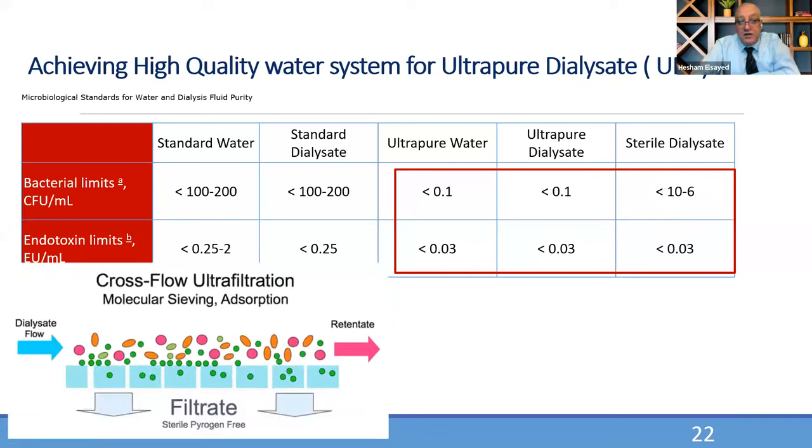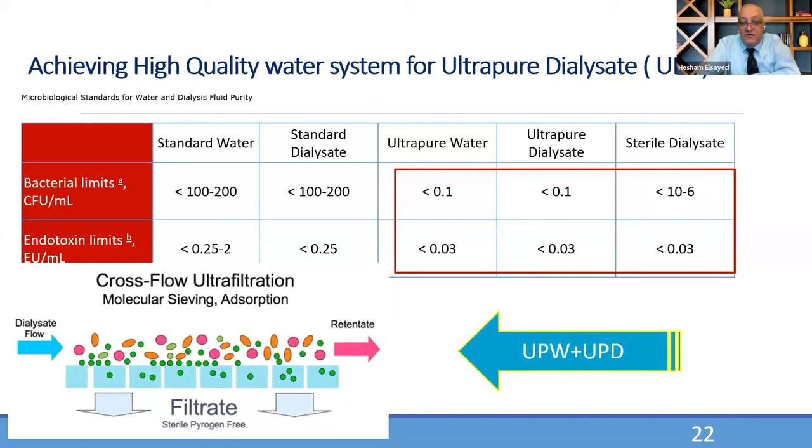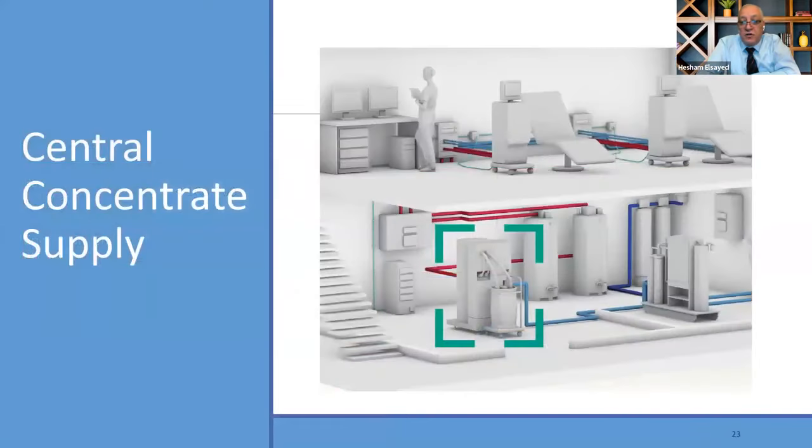It happens during the filtration process of the dialysate, and it depends on the filtration membrane. The importance of that is that the polysulfone membrane is the best, which catches the endotoxin from the water treatment station.